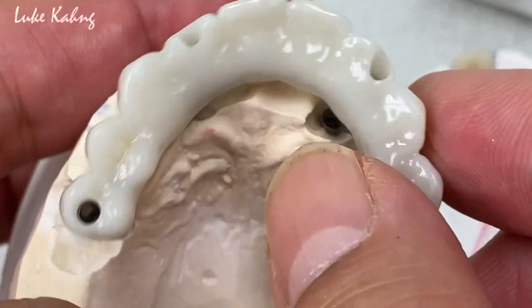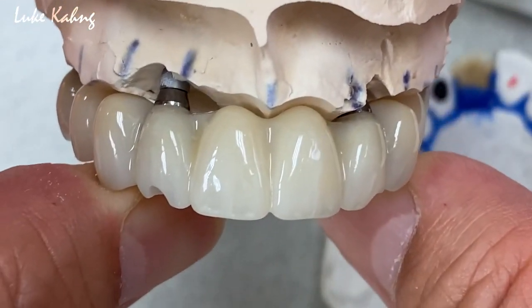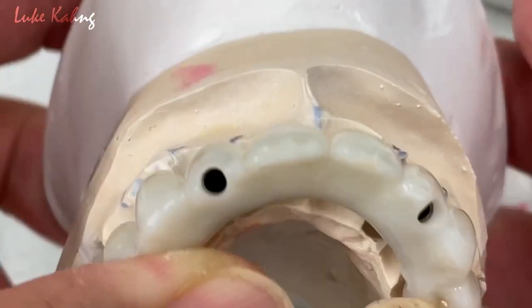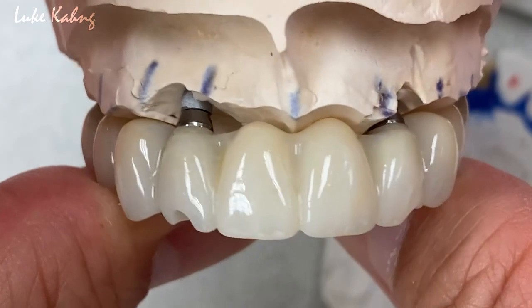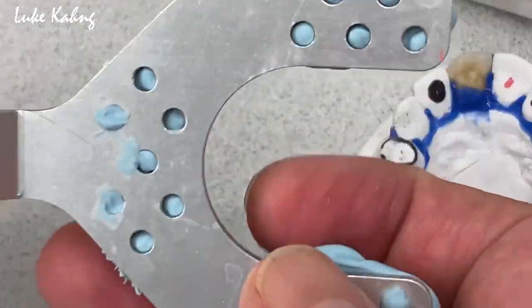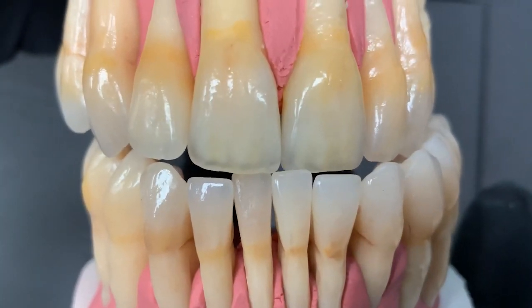We cut back everything, then we made the exceptional temporization for him. In the future, we will bring in the access hole. If doctors want, we can make it screw-retained for sure. This is great final information sent to Tennessee, and he gave us this great bite record.